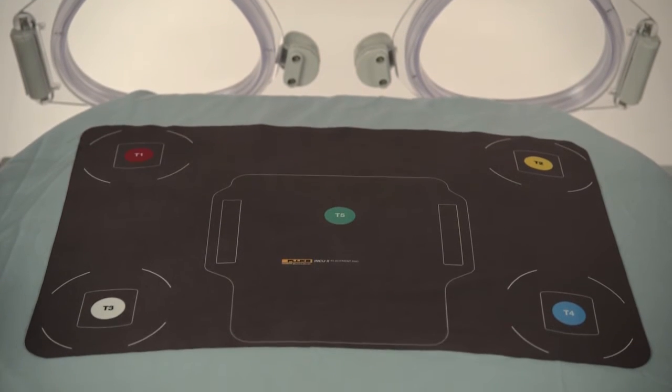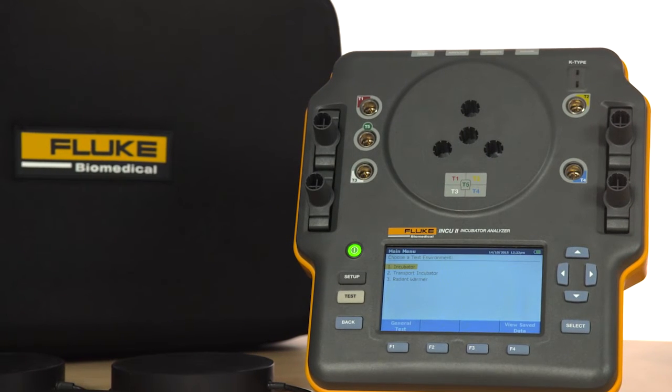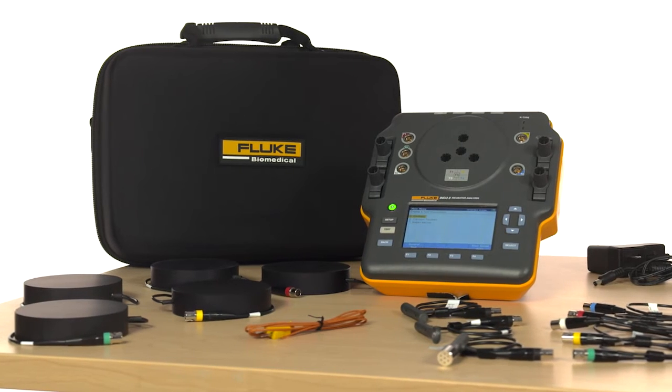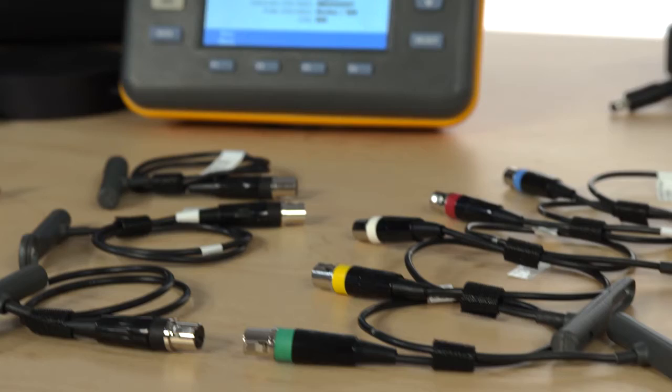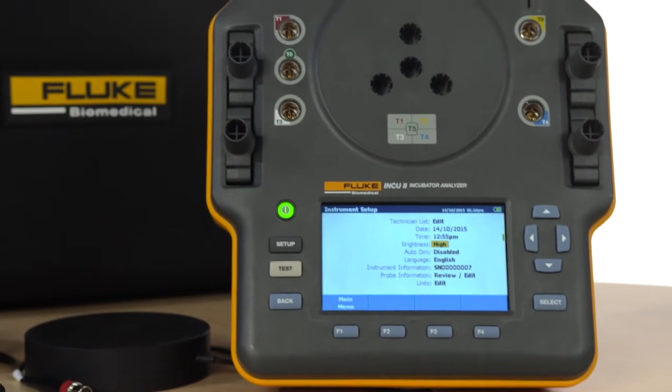The placement pad helps ensure the accurate placement of the probes for more accurate measurements. You'll appreciate its large LCD screen and a user interface that's intuitive, with built-in standard and customizable test templates that maximize your testing efficiency. The INCU II has onboard automation and comes with a Ansur software plug-in.